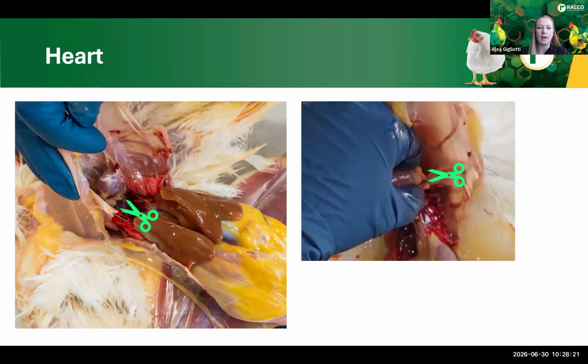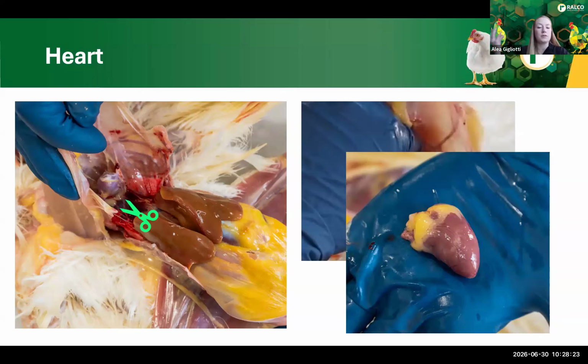And I did want to make a note here that some of these things, I have a different order that I like to go in than Tim. So we're going to go over a pretty basic order, but again, this could deviate from how you may choose to do it, as long as you're making sure you're preserving the intestinal integrity as you're going through.